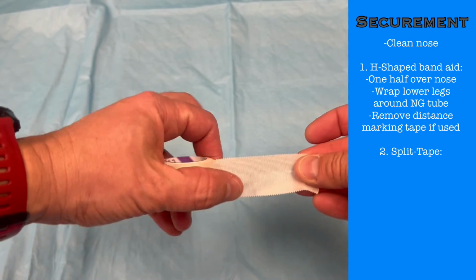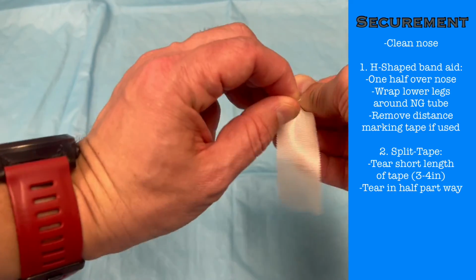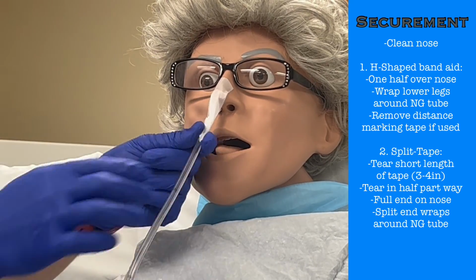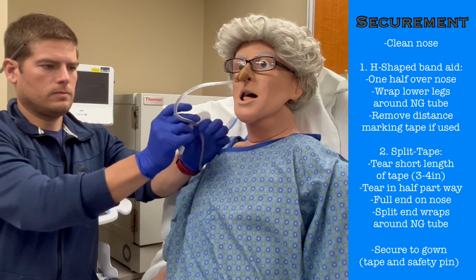If you are using tape to secure to the nose, tear off a length of tape and split it down the middle for half of the length. Attach the intact half of tape to the patient's nose, and wrap the remaining 2 ends around the tube to secure it in place. Then take another length of tape, and further down the tube, create a tab of tape.